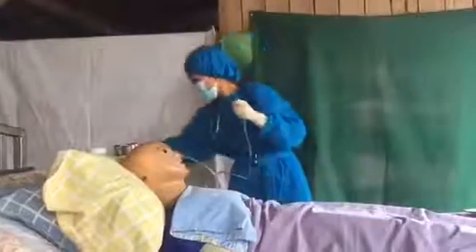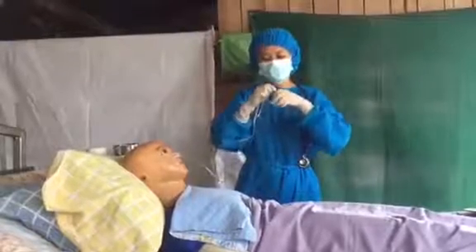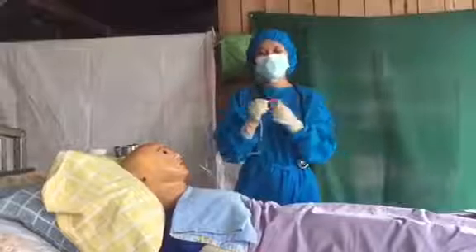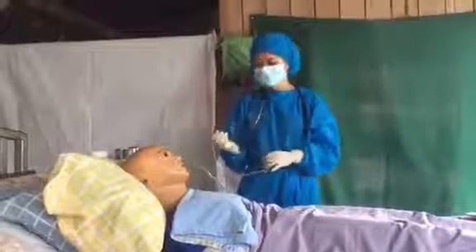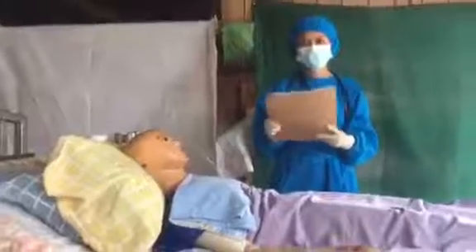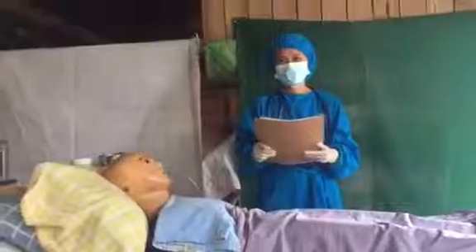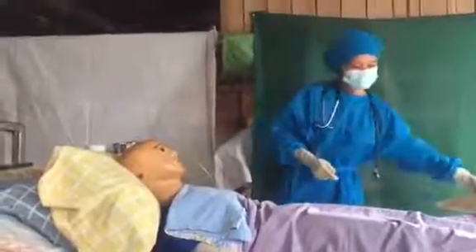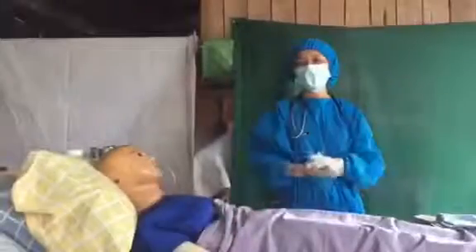Remove the asepto syringe and lock the tube to avoid entering unnecessary air. And now we're done feeding the patient. And now we're going to record the time and date, the procedure being done, and the mLs or cc's of the water, Ensure, and medicine applied. Then the reaction of the patient. Then let the patient rest for 2 hours.